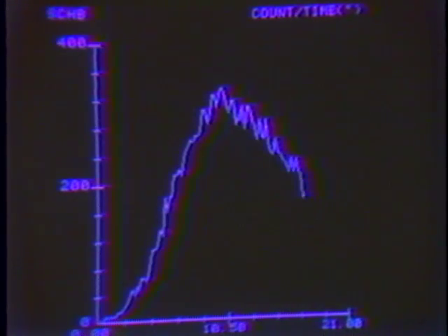Now what we're seeing here is the pattern of blood flow that the gamma camera detected and sent over to the computer, and each time the pattern of dots changes, the computer is making a measurement, and it's counting the number of dots, really, or the amount of radioactivity that is over each of those images, each of those areas. Now the computer is computing, and it's going to draw graphs representing the blood flow to each side of the head.